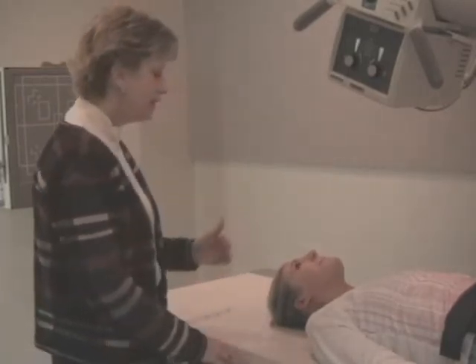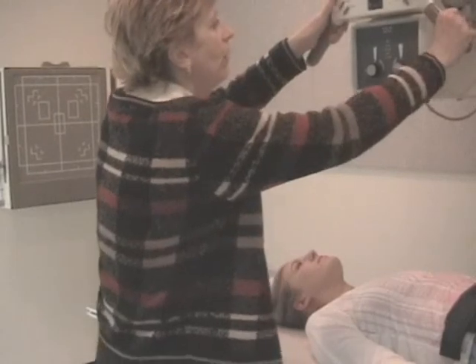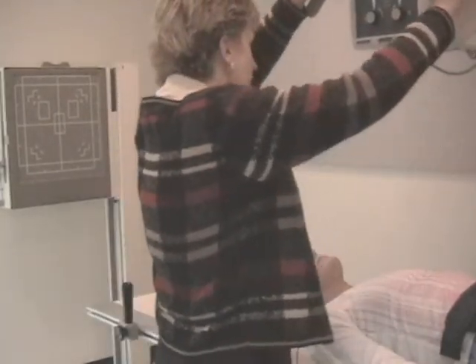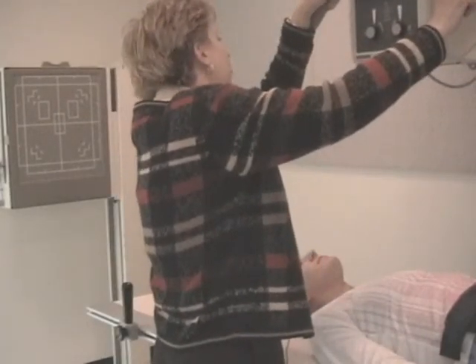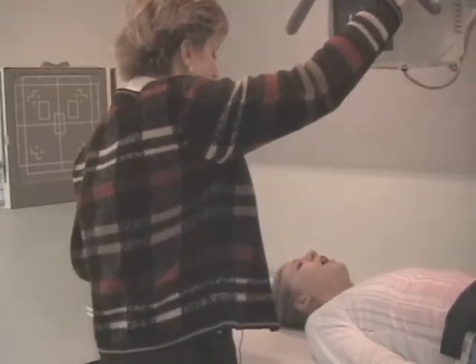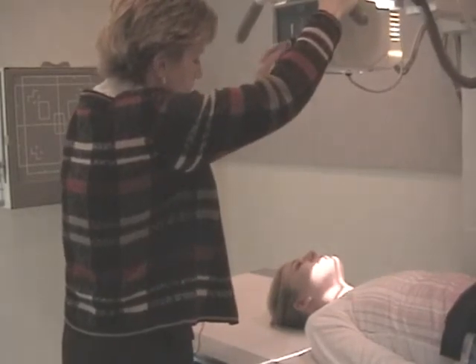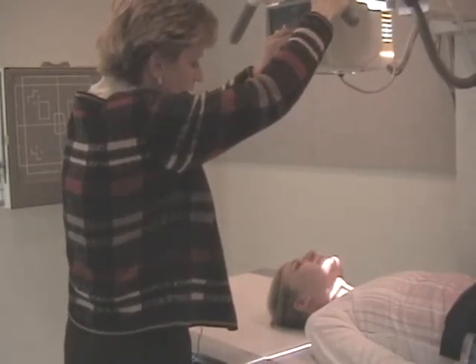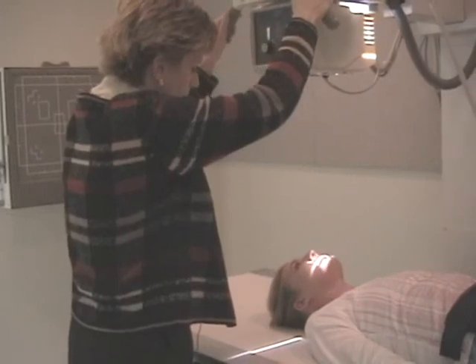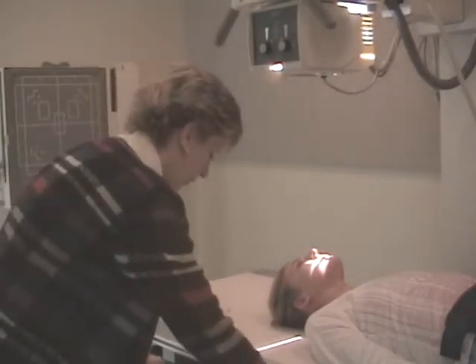The patient basically stays in the same position for the AP and the open mouth. What you do change is you do not have a tube angle on the open mouth odontoid or open mouth AP. So you go vertical, you adjust your SID back to 40. You're going to be centered over the mouth with tight collimation. Change cassettes, line things up.